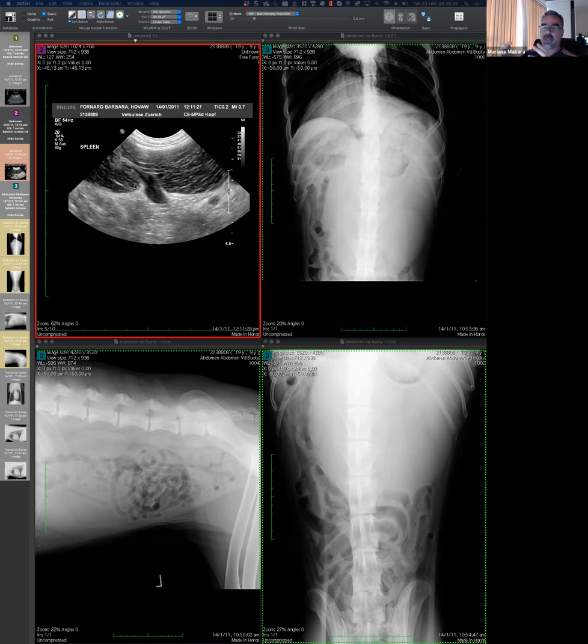It will be extremely difficult for that splenic torsion to move the stomach caudally. And that is as far as I want to use that feature. Makes sense? I want to use it, and I always use it. So if there is a mass, and I would say the same thing for the colon, for example, the small bowel.